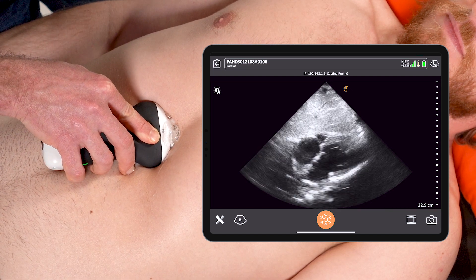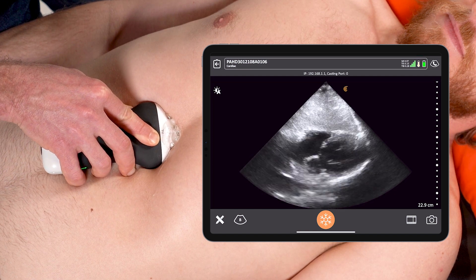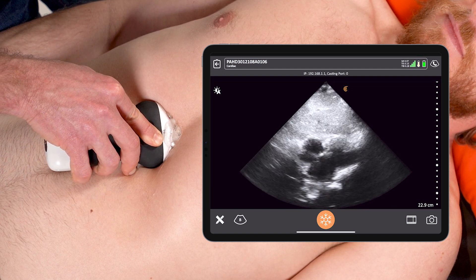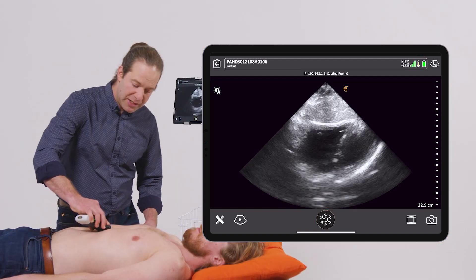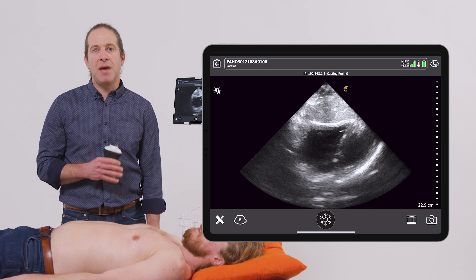Ideally, I want to fan through the heart until I can see all four quadrants. I'm going to rotate through to see all the chambers of the heart in their fullness, make sure I don't see any significant pericardial effusion or dysfunction of any of the chambers. And in that short period of time, I get an immense amount of information that can help facilitate my diagnosis and management of that patient.